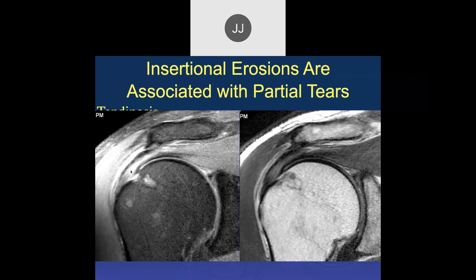The treatment here would be to leave this in a sling for a while and let things quiet down and heal. These erosions — especially at the infraspinatus insertion — are seen all the time. There are very few older adults who don't have an erosion at the infraspinatus insertion. These are due to chronic traction injuries and associated with little partial tears that tend to heal in most people. But if you overuse it, they'll go into a full-thickness tear.